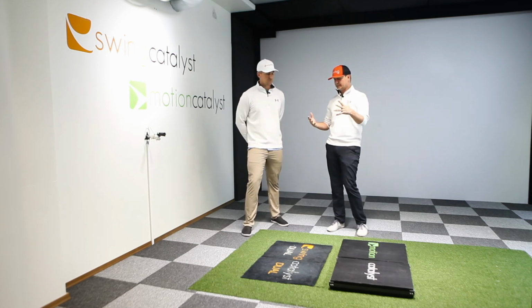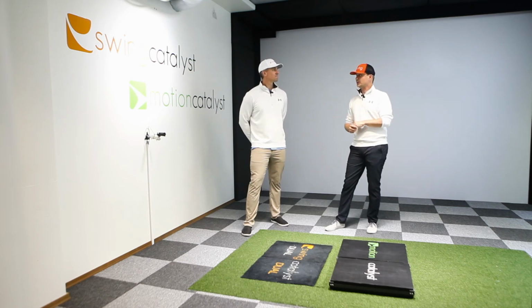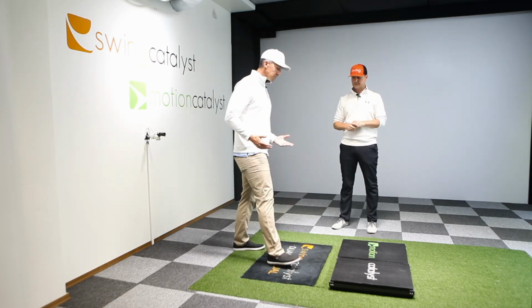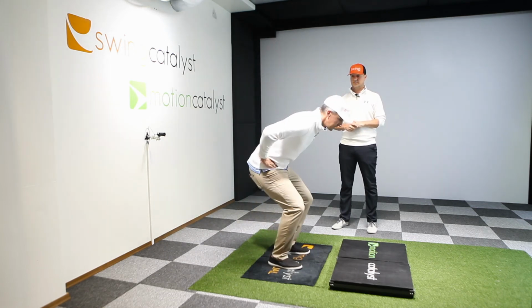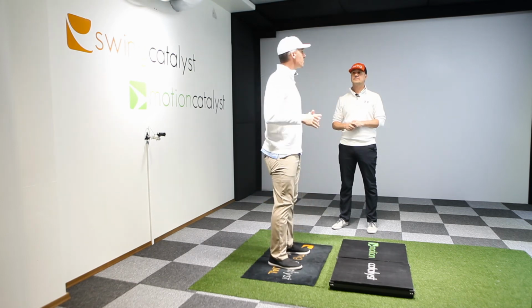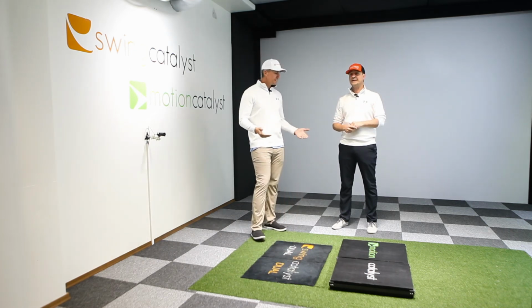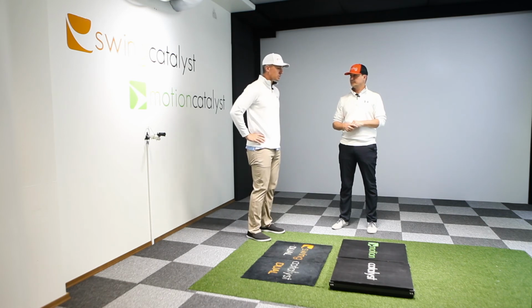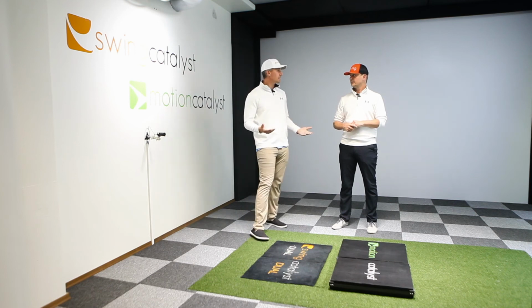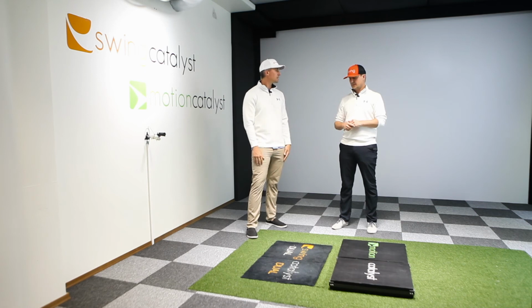So for example, let's say a squat jump. There are things that somebody could do to mess with those results as well. So what have you seen in squat jumps that could make them? A squat jump would theoretically be, you would stand on the plates, get your body weight, sit down to 90 degrees and hold still. If I were to drop and go, that would be a problem because it's no longer a static squat jump. No, that's a counter movement jump. Correct. Or in a counter movement jump, if I were to stand still, eject some positive impulse, then drop into my test, it affects the acceleration on the downward start. So either of those things can mess with results.